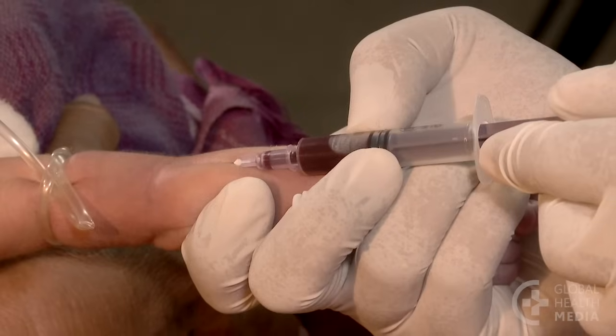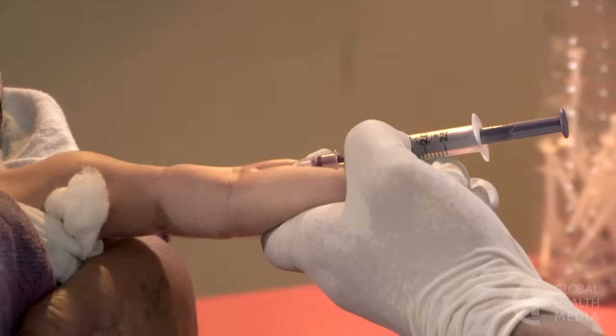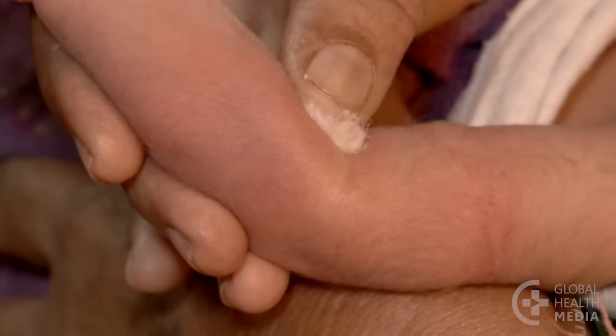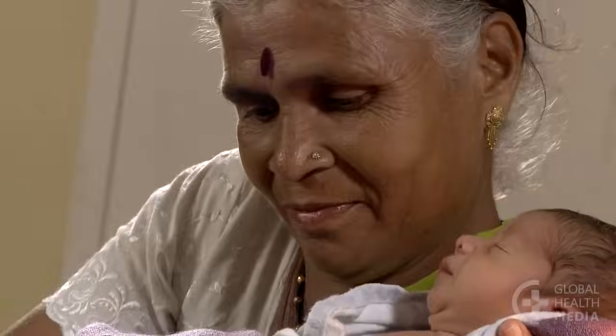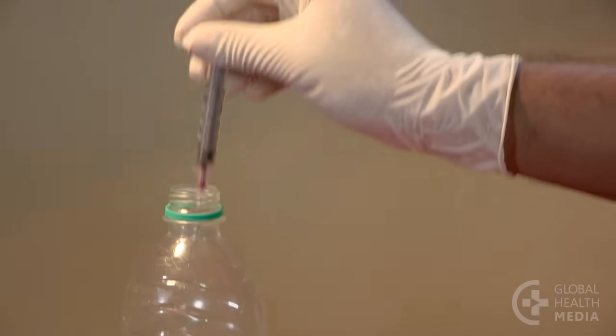Draw up the amount of blood you need, then release the tourniquet, remove the needle, and cover the site with a cotton ball. Fill the labeled tube and safely dispose of the needle.